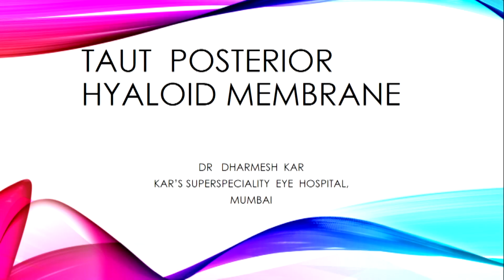Srinivas, very nice presentation and very nice videos. I just feel in one of the videos which you showed, there was a remnant of the vitreous, and probably if that vitreous had been identified initially, the hole would have closed with just removal of that remnant only. You know, because I think it was pretty large. It was more than 1,000.